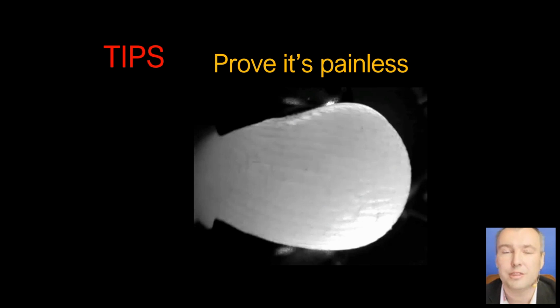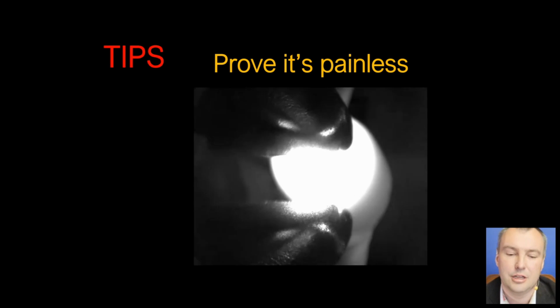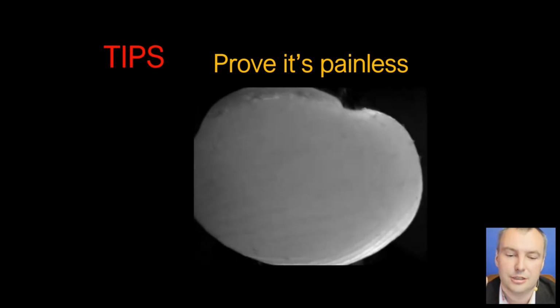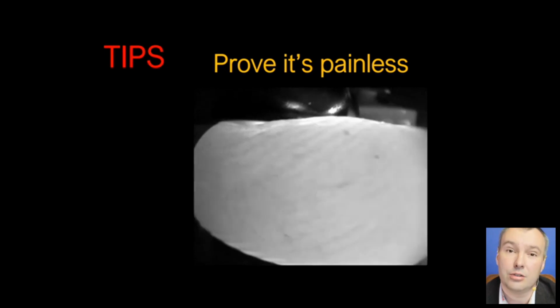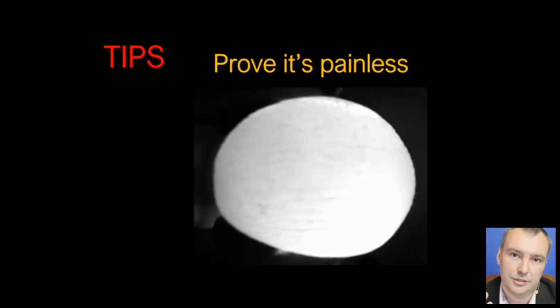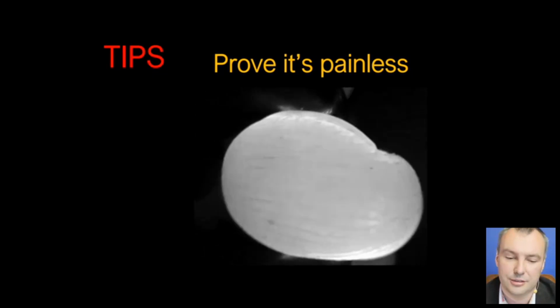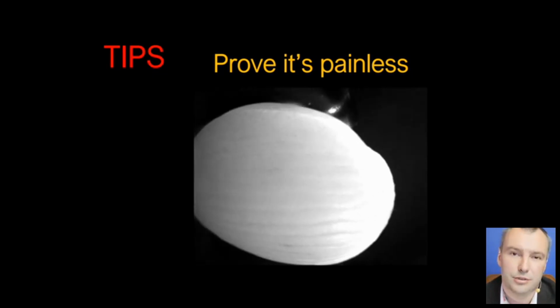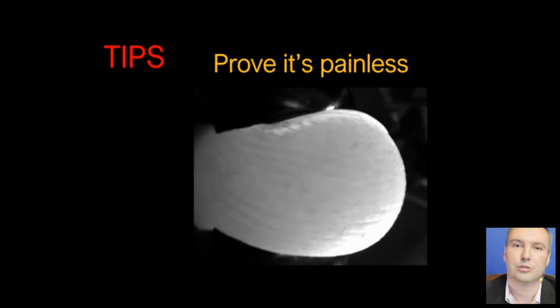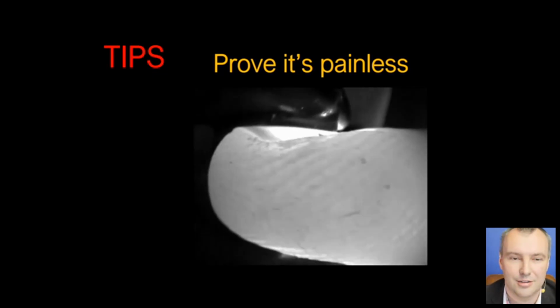Child patients will be afraid of the DiagnoCam. This is how to prove the DiagnoCam is painless. You take your finger, you press it, and you show it on your finger, or even better, as in this case, on your patient's finger. If it's not painful on the finger, surely it won't be painful on the tooth. Works perfectly every time.